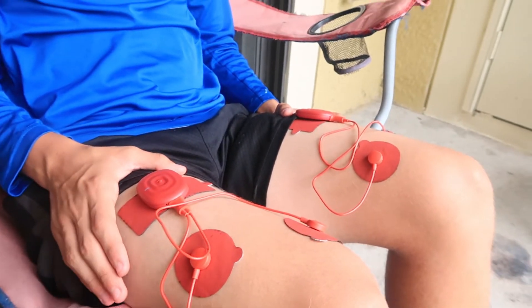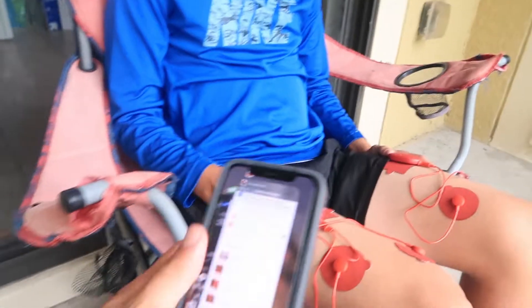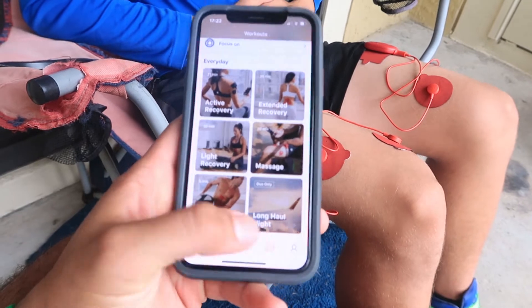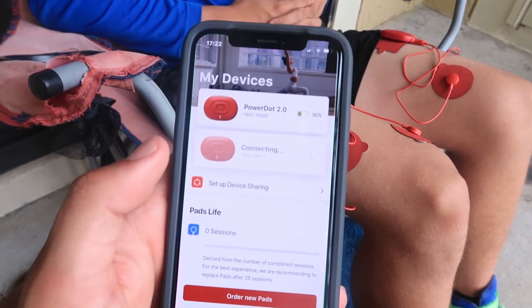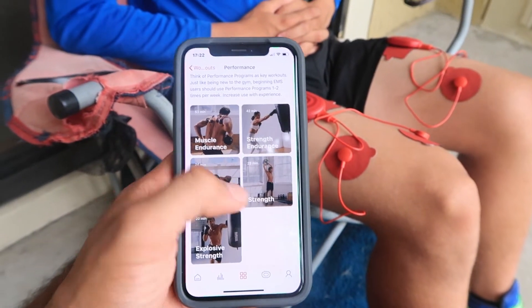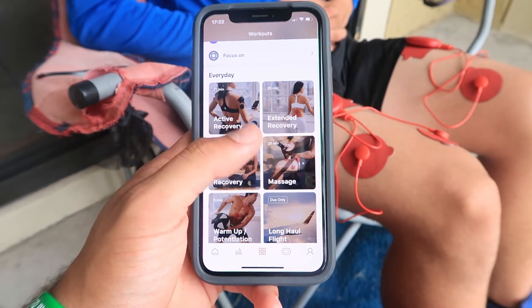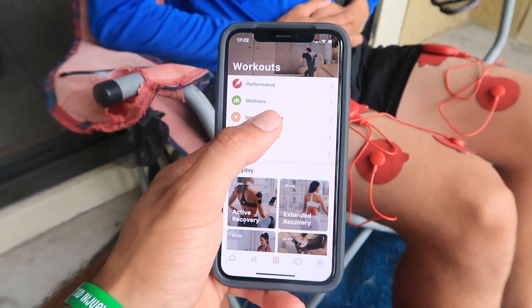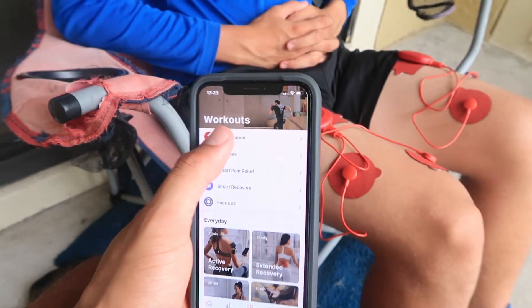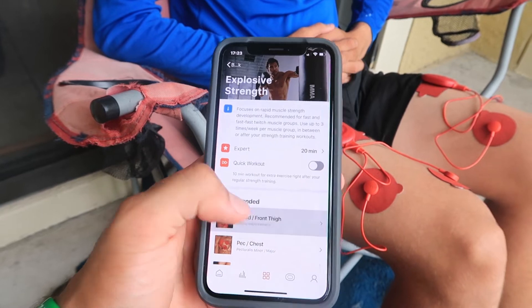This is what it looks like once everything is set up. I'll hold it and go to the app, which connects via Bluetooth. Once those are connected, they have options like performance workouts, muscle endurance, strength endurance, resistance strength, explosive strength, and things like massage, warm-up, light recovery, active recovery, smart recovery, smart pain relief, and wellness. They have a lot of options — all done with electrical stimulation. I'm going to put Roman through explosive strength so he gets a feel of what it's like.